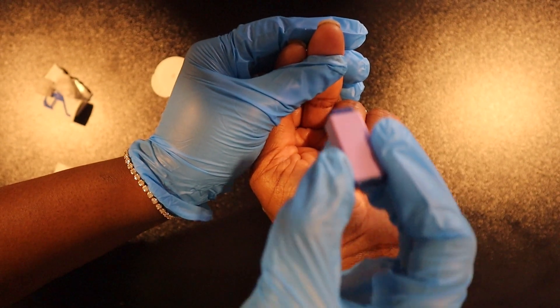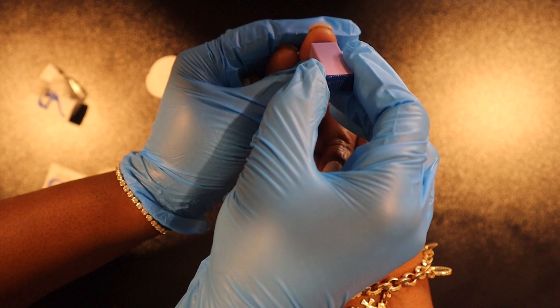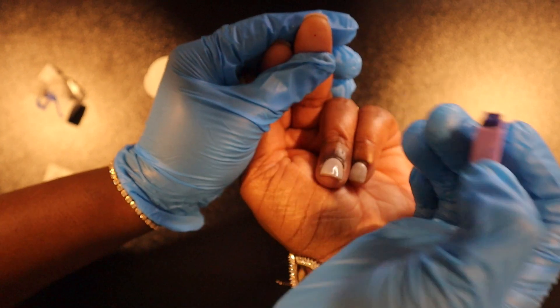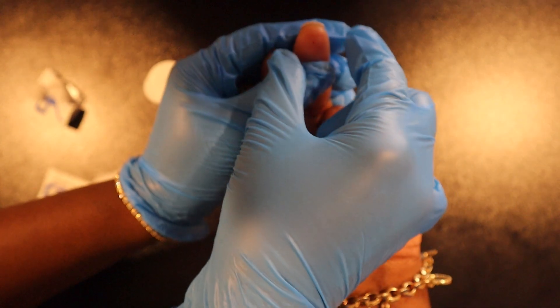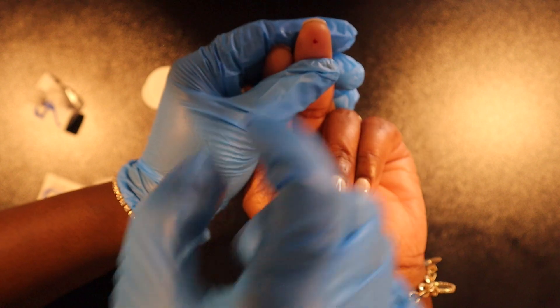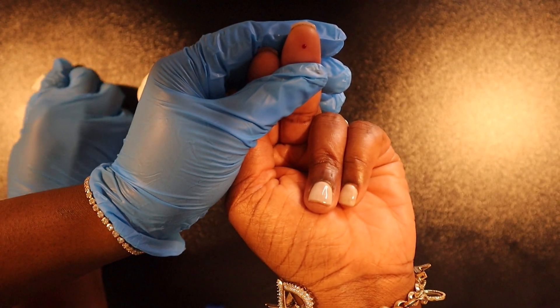In this video, I will increase blood flow according to the CDC by pressing firmly on the finger while making the puncture. We can now prick the finger to obtain our drop of blood — by pressing the lancet firmly against the finger, you will activate the needle and puncture the site. Most organizations will encourage you to prick the side of the finger because there are less nerves and more vessels.